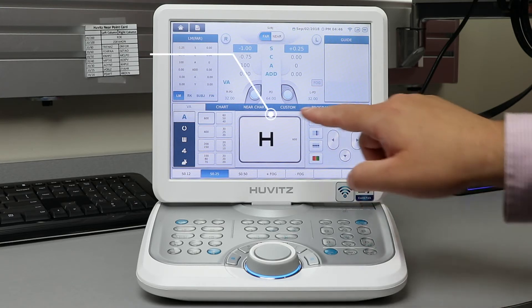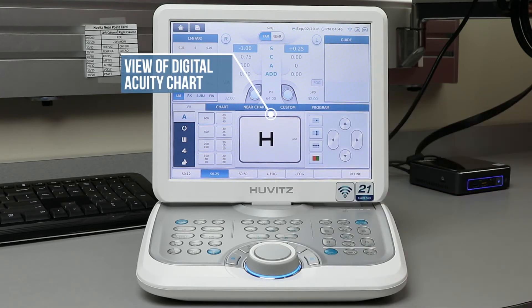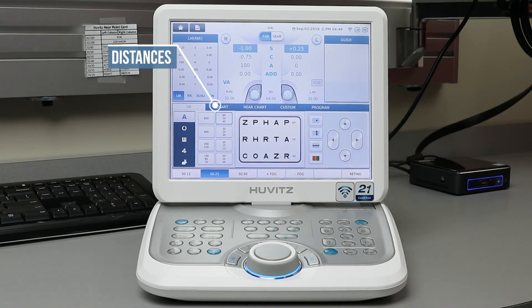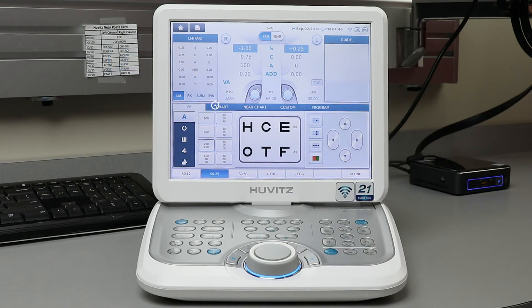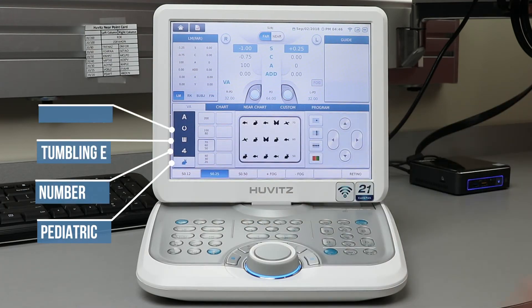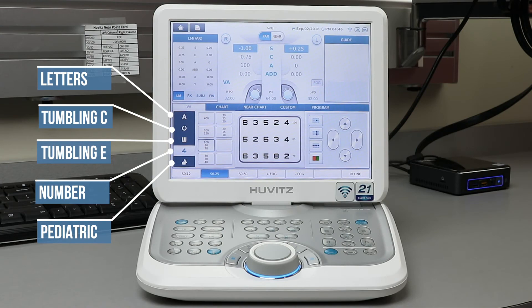In the center, you will see what is projected on your digital acuity chart. To the left-hand side, you will be able to use the buttons to change your distances, as well as which chart you would like to project. On the far left, you will see Pediatric, Number, Tumbling E, Tumbling C, and Letters.